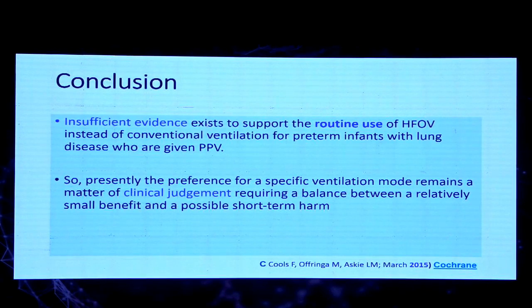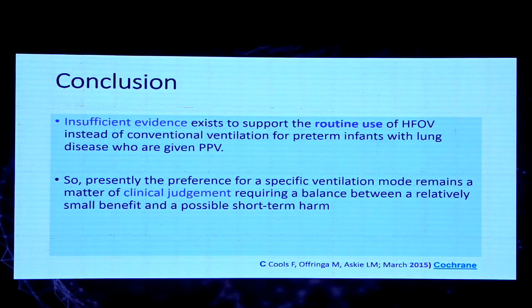So that's why, in conclusion, insufficient evidence exists to support the routine use of high frequency instead of conventional ventilation for preterm infants with lung disease who are given PPV. So presently, the preference for a specific ventilation mode remains open and remains a matter of clinical judgment. Those centers who are used to high frequency, they are experts in using it, they continue to use it, that's fine. And those who do not have the experience probably should continue to use conventional ventilation.